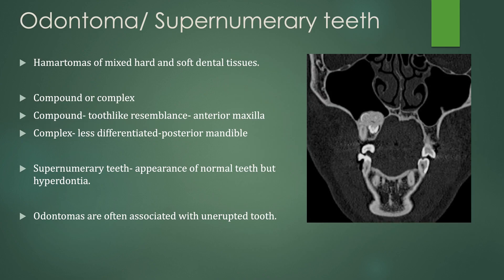Now for sclerotic lesions. First is an odontoma, or supernumerary teeth. These are hamartomas of mixed hard and soft dental tissues. You can have compound or complex odontomas. The compound ones have a tooth-like resemblance and tend to be in the anterior maxilla, whereas complex odontomas are less differentiated and in the posterior mandible, so they won't necessarily look like teeth, although they might have tooth elements within them. Here is that sclerotic appearance with tooth pieces within a sclerotic lesion in the maxilla. They are also associated with unerupted teeth. Supernumerary teeth have the appearance of normal teeth, but hyperdontous — a tooth that is more than you are supposed to have.